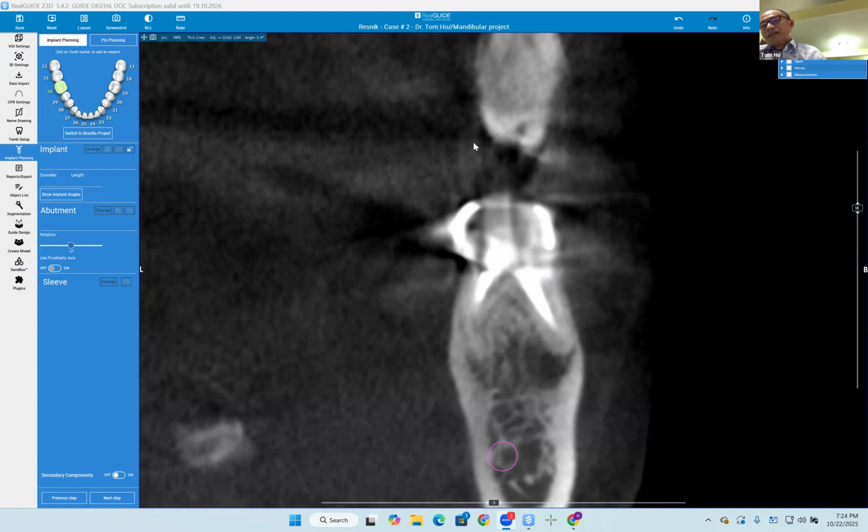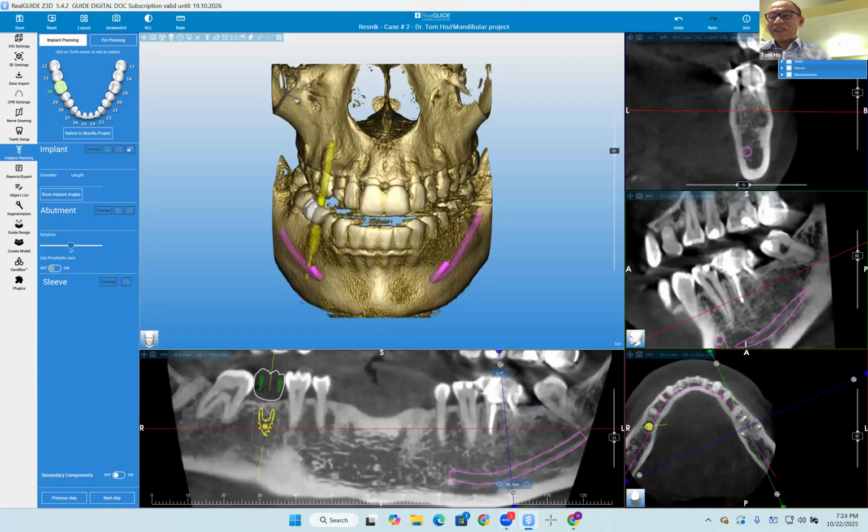Yes, that's what I planned. And whenever you take a scan, always keep watching it. You can actually measure that lesion. Go to the pre-op scan, measure it, and then go to this one. If it's decreasing in size, then it's fine. Okay. I misunderstood. Sorry about that. Thank you.